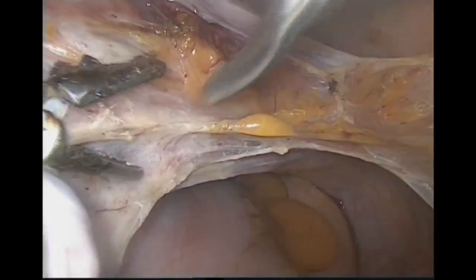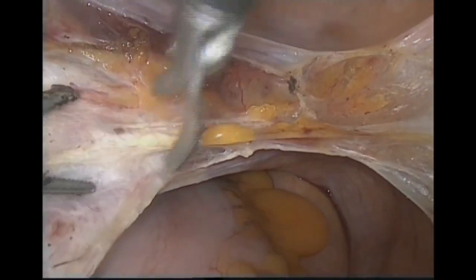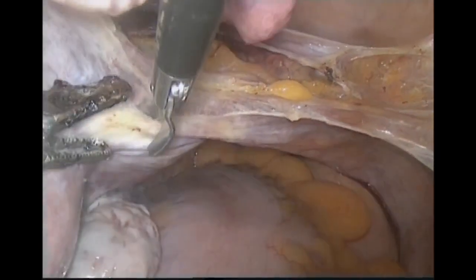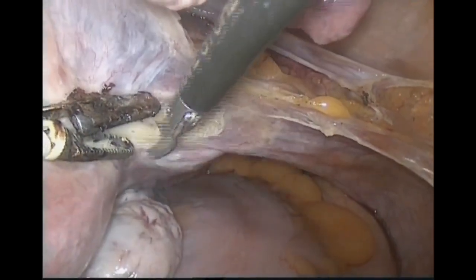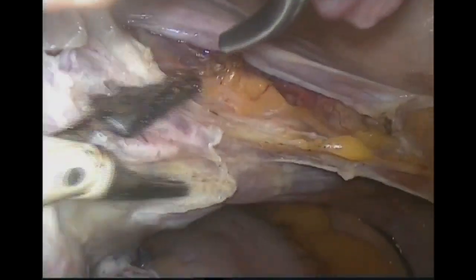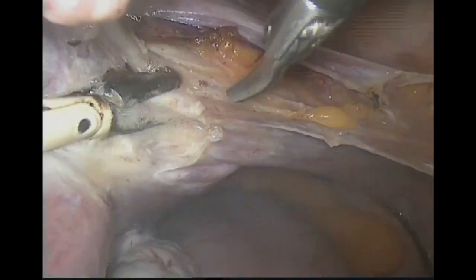So please, according to the guideline, do not leave any tubal part or any ovarian part, to completely remove the adnexa, a complete salpingo-oophorectomy, as you can see. Then you can peritonize and dissect the posterior wall to keep the uterus more mobile, to take the uterine artery in a safe way, to skeletonize the blood vessels in the very easy wall, as you see.